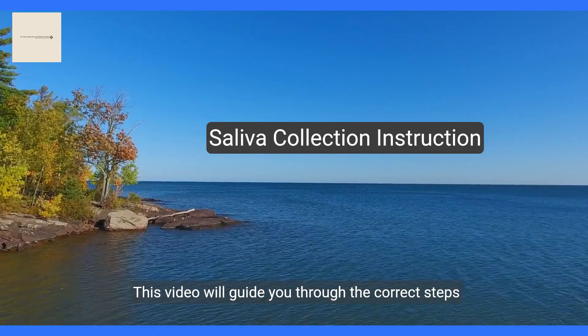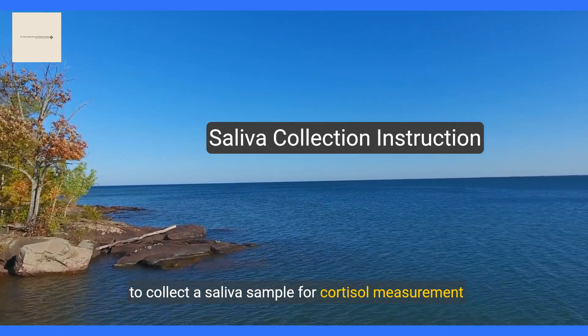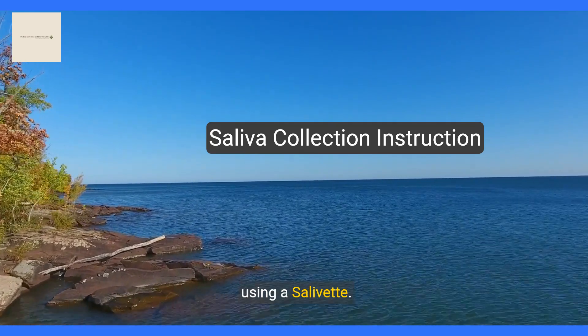Welcome. This video will guide you through the correct steps to collect a saliva sample for cortisol measurement using a salivette.